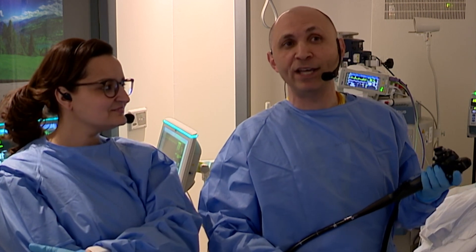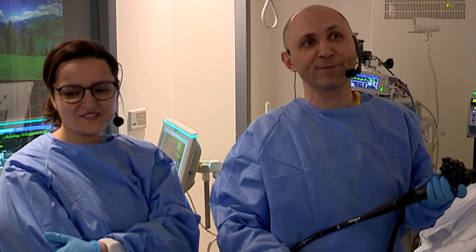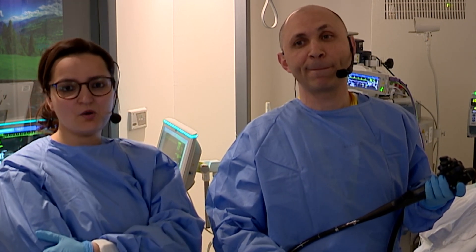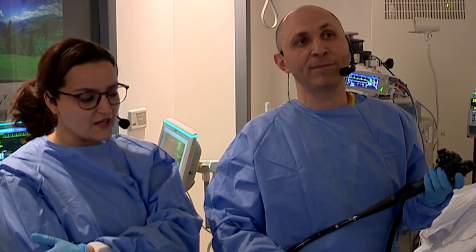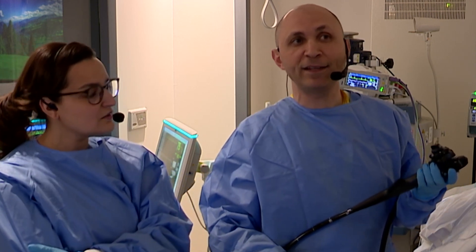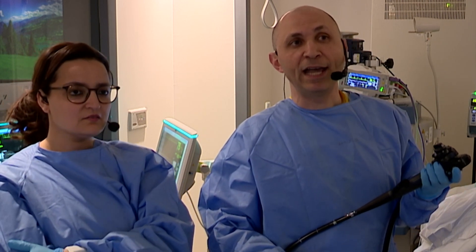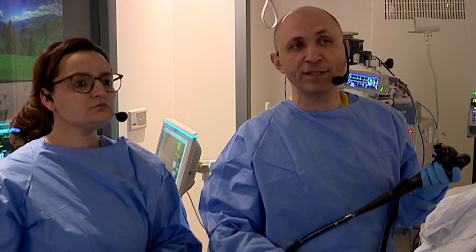Our case today — Nada, could you introduce the case, please? Thank you, Dr. Amr. It's my pleasure to be with you, my professor. Today we have a female patient, 29 years old, who came complaining of persistent abdominal pain and dysphagia. The upper endoscopy was normal, and now we are doing EUS directly. There is a suspected subcardiac lesion, cystic, and we're trying to discriminate the type of the lesion — is it a pseudocyst, a duplicate cyst, or something else?